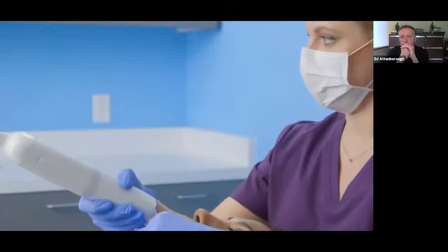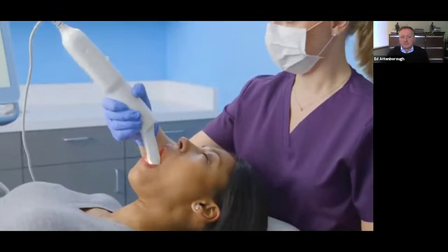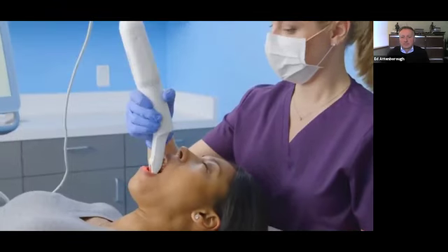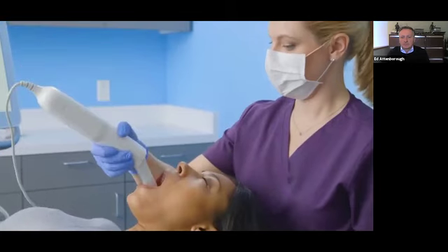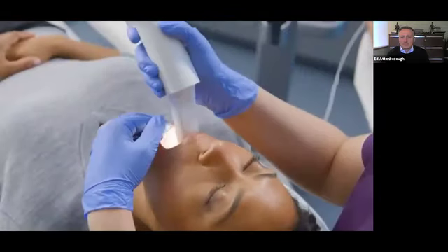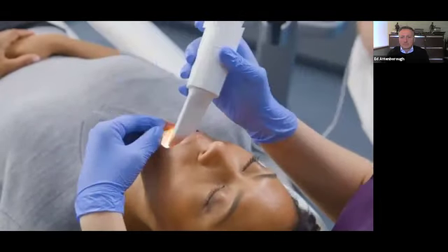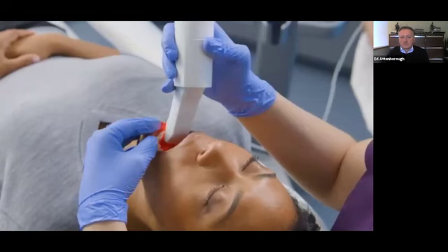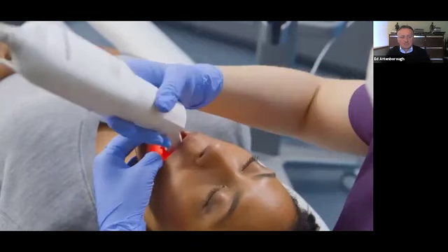In the occlusal scan, when I come to the anterior 6 teeth, I tip the cord end of the wand up to capture more surface area and lingual anatomy, rather than scanning only the incisal edges. When I transition to the lingual, I bring the cord end of the wand out to the side. Then, in a smooth motion, I bring the wand around the arch, keeping the wand tip tilted towards and facing the anatomy I am scanning.